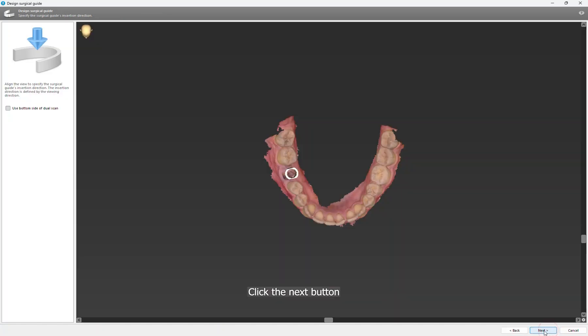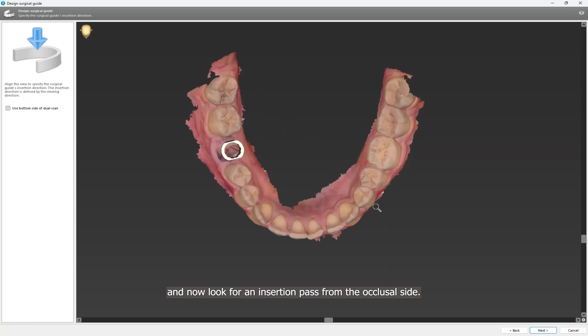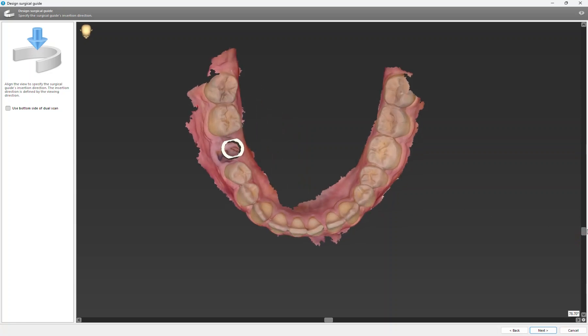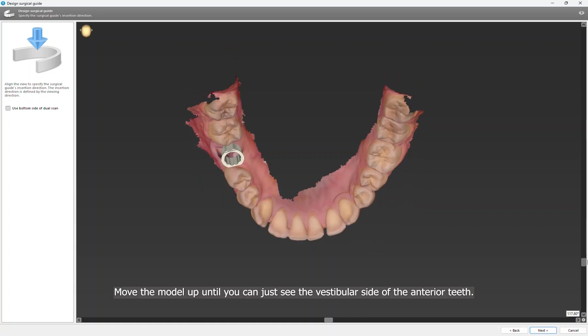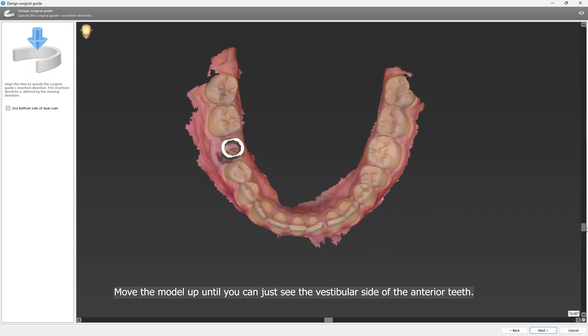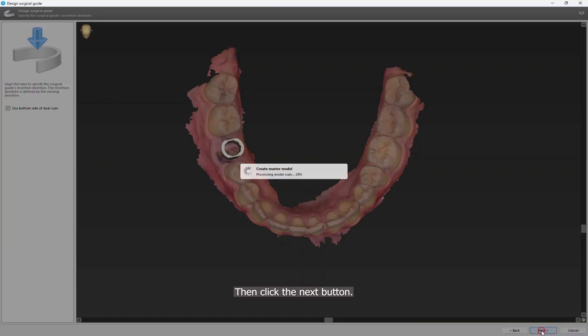Then you choose the model which you want the guide to be designed on. Click the Next button. And now look for an insertion path from the occlusal side. Move the model up until you can just see the vestibular side of the anterior teeth, then click the Next button.